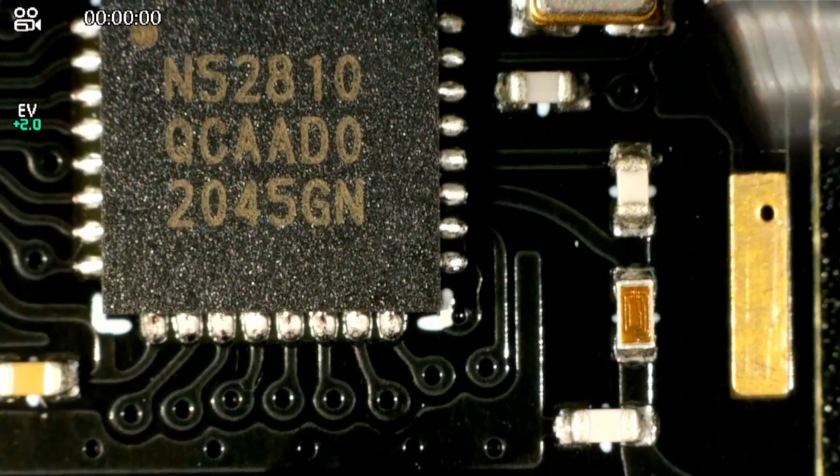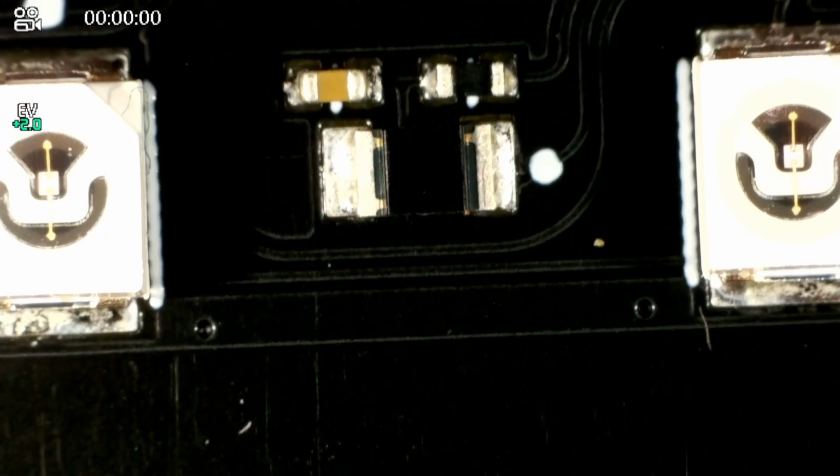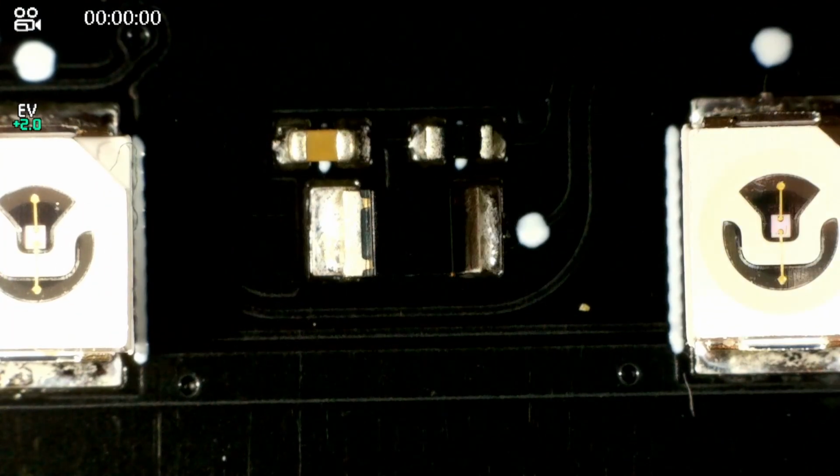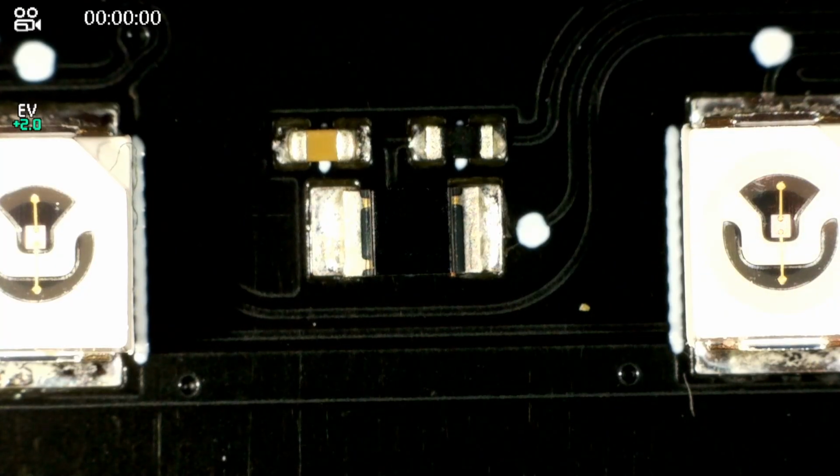And then there is our antenna right there. This looks like some kind of an inductor for the matching network. Here's a shunt cap there, and that is our antenna trace. It's going to be barely visible on camera because of the black silk screen. And then that's it, not much else. There's a bunch of passives there. Then we got two LEDs here and a detector in the center. Now these LEDs, I don't think, are what is reading the actual result. It looks like they perhaps monitor that the dye is progressing throughout the strip, because as it gets wicked away, there is kind of a forefront of dye that moves forward, and I think this is what it's reading to make sure that it is actually happening, so that the results are going to be correct.